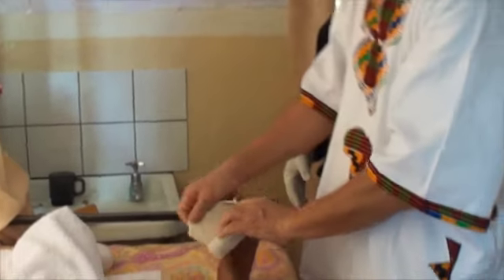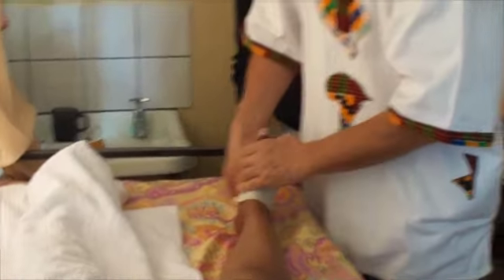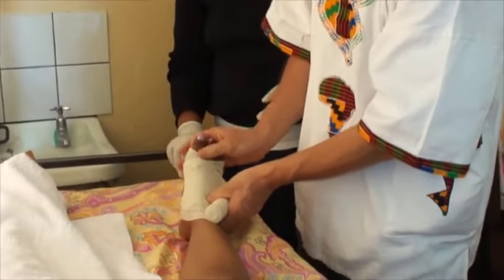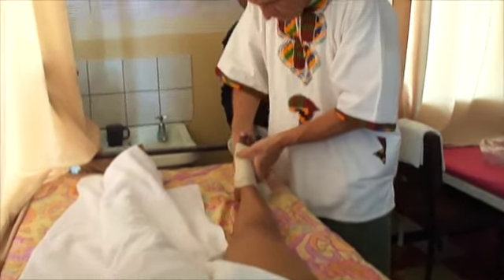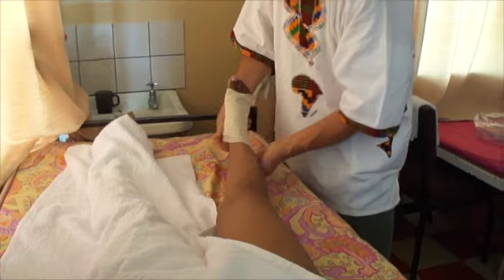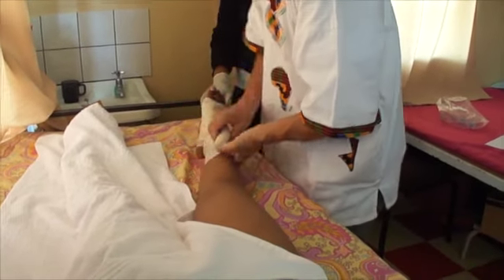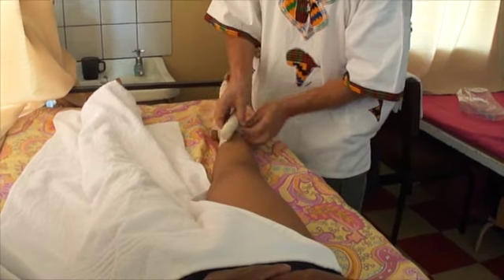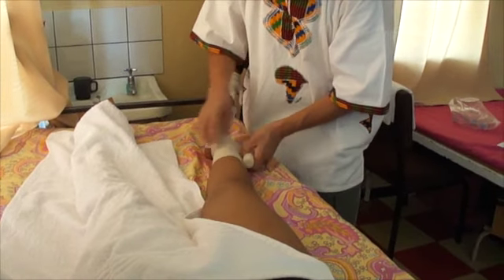I want to show you now — Ms. Sophia can help me. I am starting on the foot here. Let the toes free so that they can move. You see, half of the bandage should cover the bandage from before.